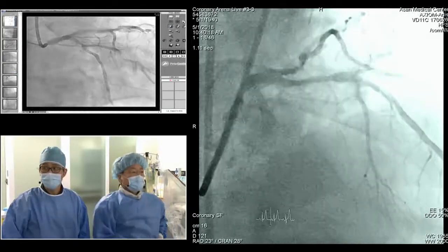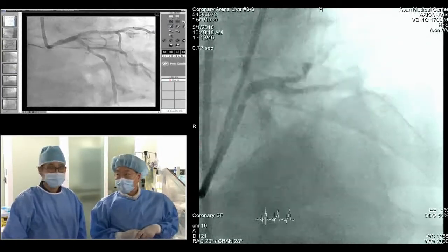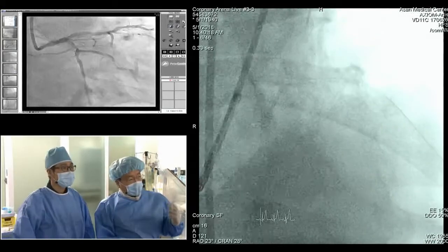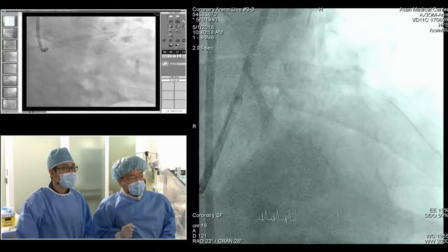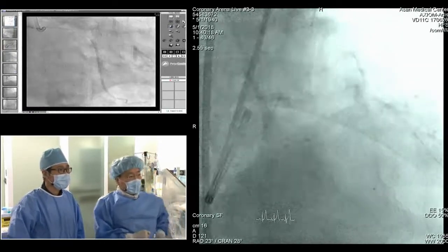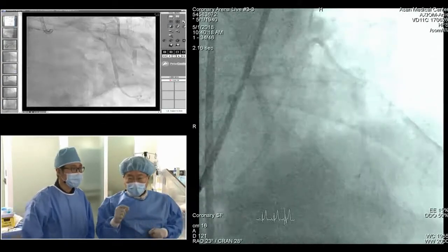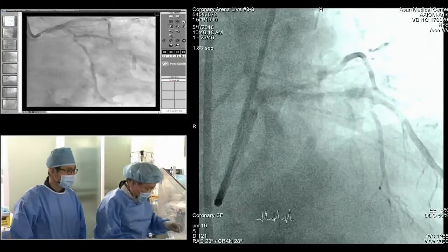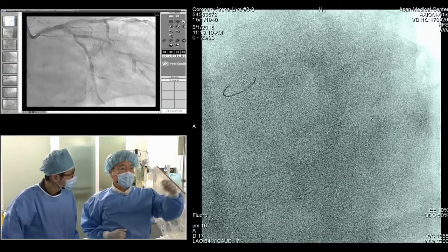It was very difficult to engage the guiding catheter due to mainly ostial left main disease, so ultimately we used a 7 French Judkins 3.5 guiding catheter for the left main, and then wired the LAD first. We would like another wire for protection of the circumflex. However, our main issue is, okay, just a minute, blood pressure is, would you show the AP cranial view? Exactly the same.